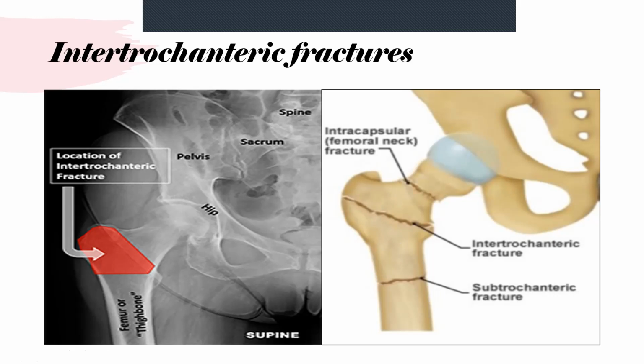Now, are they associated with other trauma? Yes, especially pelvic trauma, depending on which direction the trauma came from. So generally, most of the trauma comes from falls. It's not as severe in the pelvis, but you can look at the acetabulum and the rami. You do sometimes get injuries there as well.